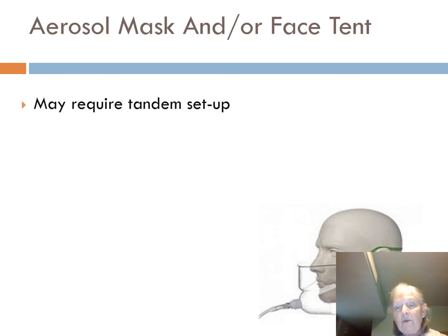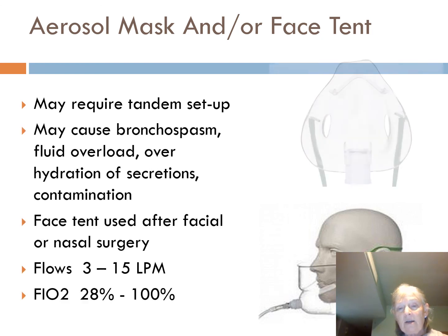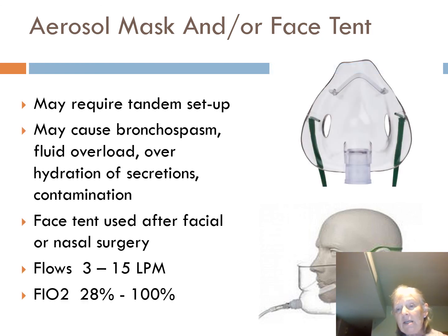And there's your aerosol mask. There we go. And you can see there's the holes on the side of it. This is called a face tent, okay? Some people go, well, that's a tent. Well, not literally, there is a tent, but that's not it.